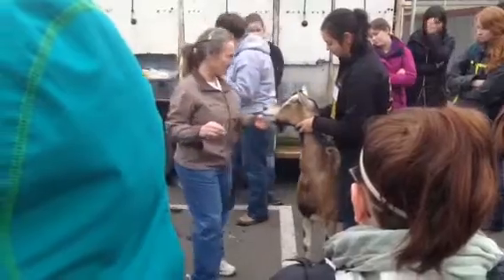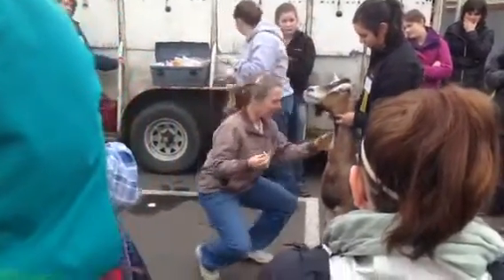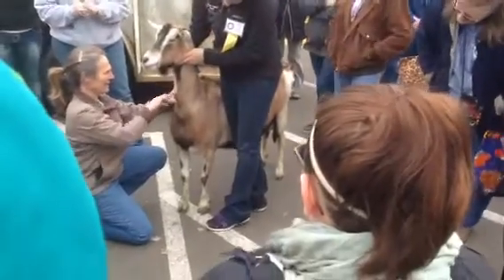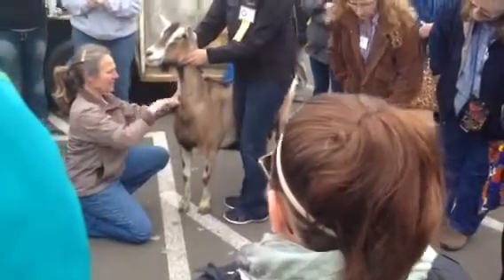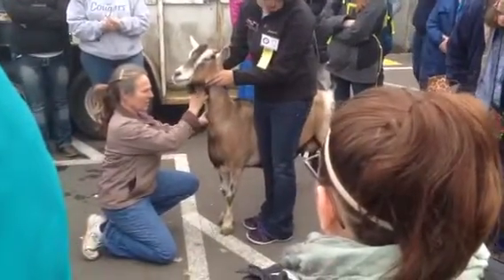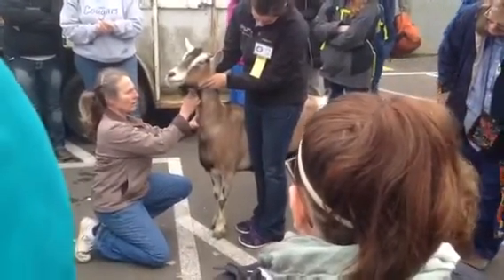We'll fake it. Fake it till you make it. So, get your vein — nice big vein.